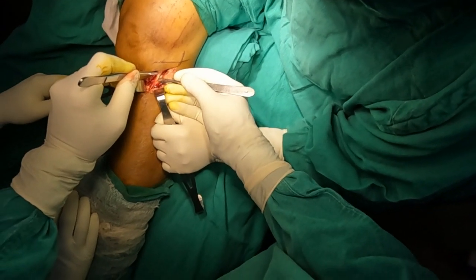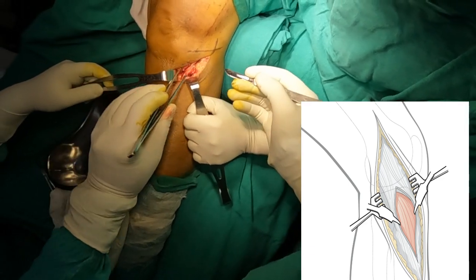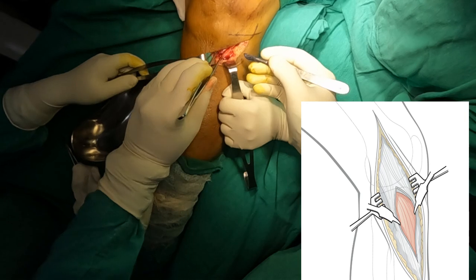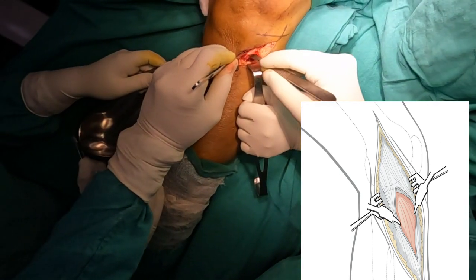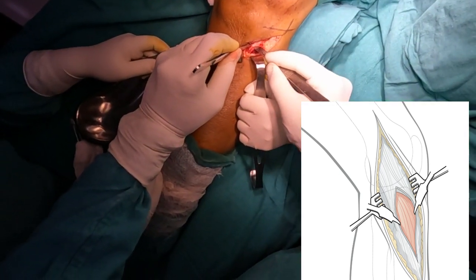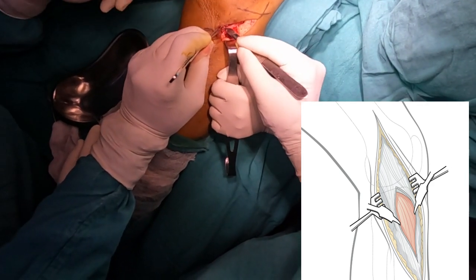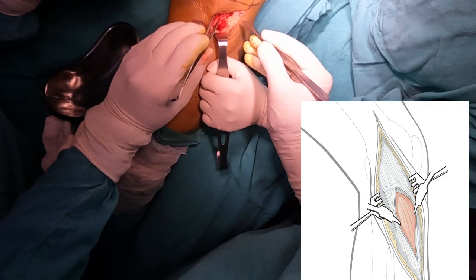After incising the skin and subcutaneous tissue, we open the deep fascia by splitting the iliotibial tract down to Gerdy's tubercle along the line of skin incision. The IT band is then elevated as a full thickness cuff both anteriorly and posteriorly using sharp dissection.